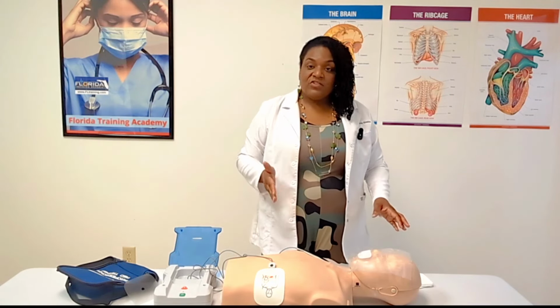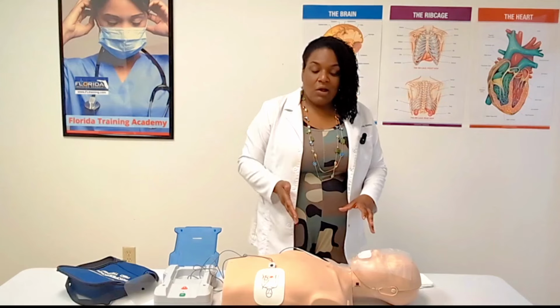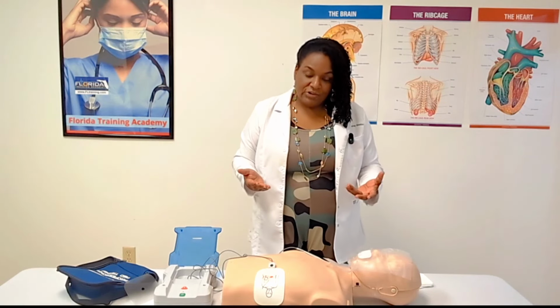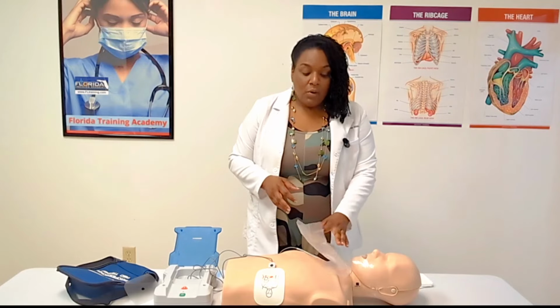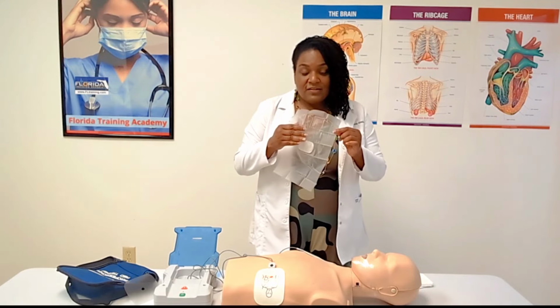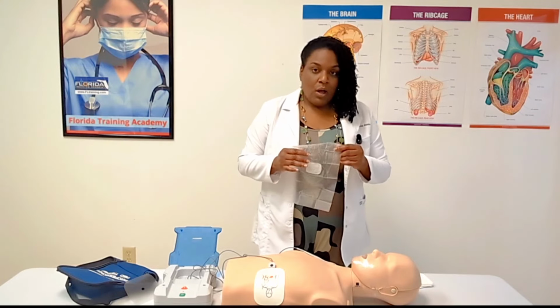There is no residual charge. As soon as the shock is given, you can return and start doing your high quality compressions or CPR, beginning with your chest compressions. It won't hurt if you leave this on the victim's face, but if you decide to take it off after you give your 2 breaths, you're more than welcome to do so.